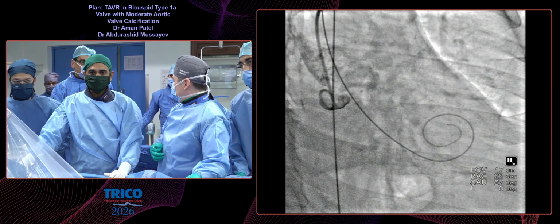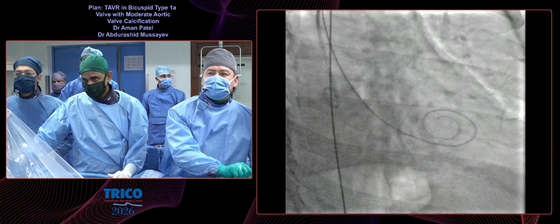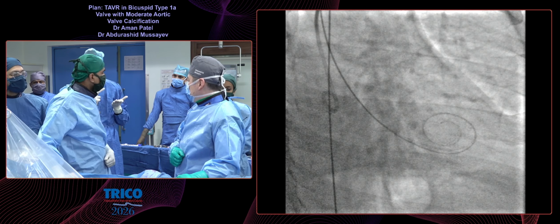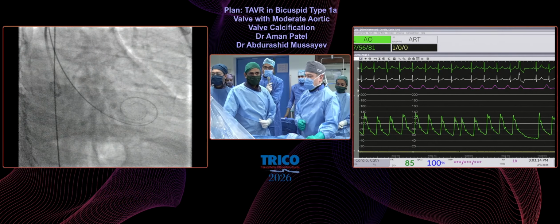Okay. So if this was a tricuspid valve stenosis, would you predilate, or do all bicuspids need predilatation? With this much amount of calcium and the angle of delivery, I would not predilate if it was a tricuspid valve. But it's because of that fused cusp and whatever gain we can get. I don't think we are going to be able to open the fused area of the cusp. But even if we can get a little gain, probably we can reduce the paravalvular leak risk. That is the reason I would predilate.